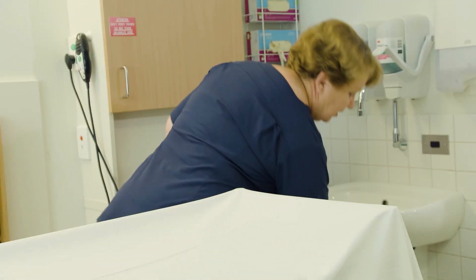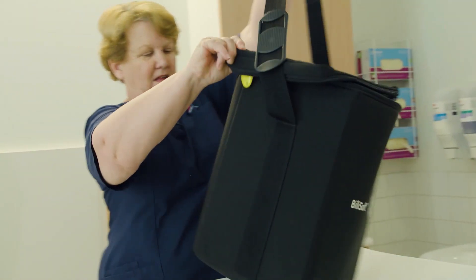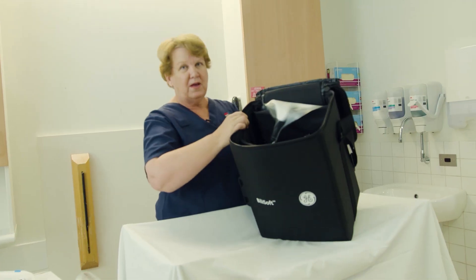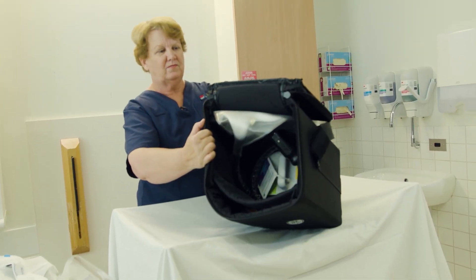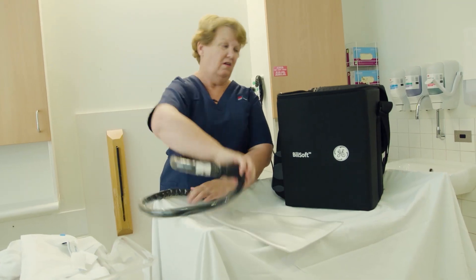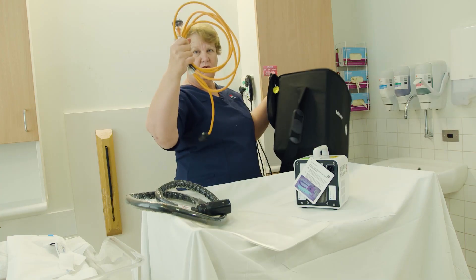BillySoft will come to you in a carry bag. Inside the carry bag there will be three parts to the equipment: the soft mat that the baby's going to lie on, the machine, and the power cord.